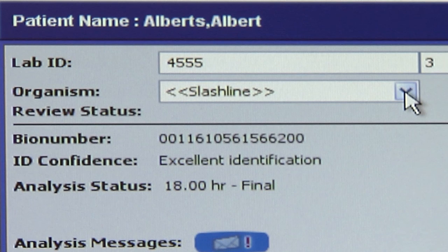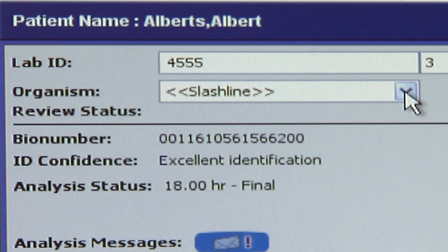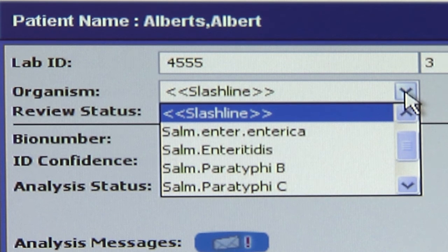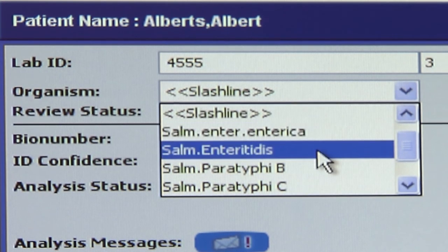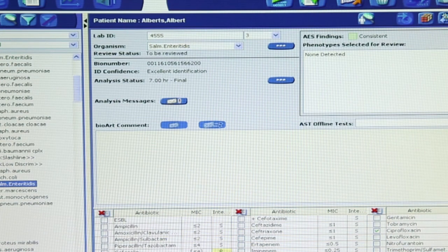Second, is slash line displayed in the organism field? When species within a genus are too similar to distinguish, they display as slash line in the organism field. Click in the organism field to display a drop-down list of the organism choices. Click to select the appropriate organism. The software will analyze the results automatically once the organism name is selected.